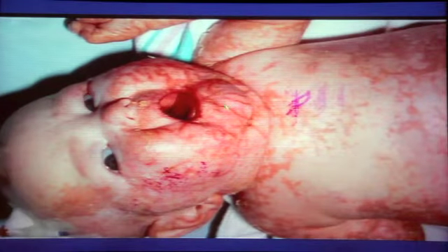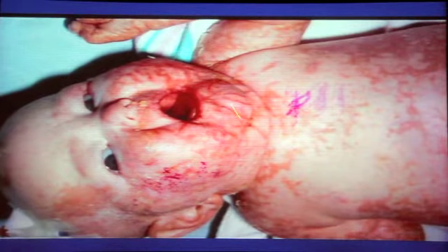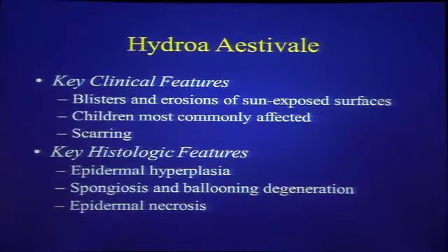And this is a little kiddo that had acrodermatitis enteropathica. And this is what that biopsy looked like. Again, notice the extensive ballooning degeneration of the epidermis with somewhat of an infiltrate in the dermis of lymphocytes and perhaps a few neutrophils. As time goes on, you actually get some parakeratosis, and eventually the ballooning kind of goes away, and you're left with mostly just a psoriasiform dermatitis. But early on, it looks very characteristic, where you get this ballooning degeneration with parakeratosis and an overlying basket weave cornified layer overlying that with a variable infiltrate.